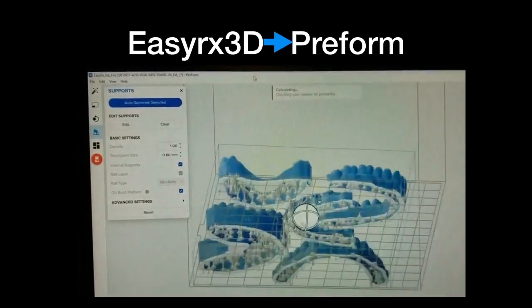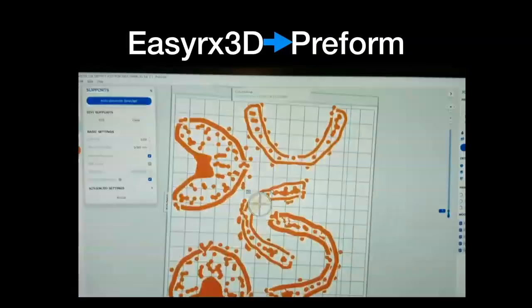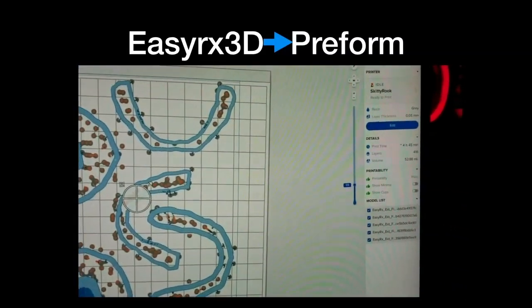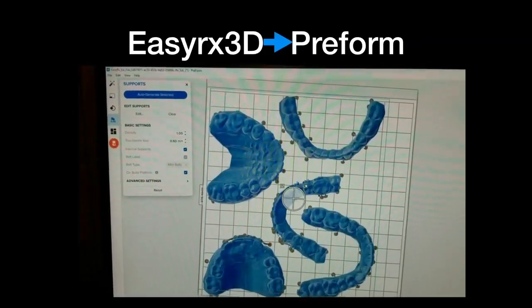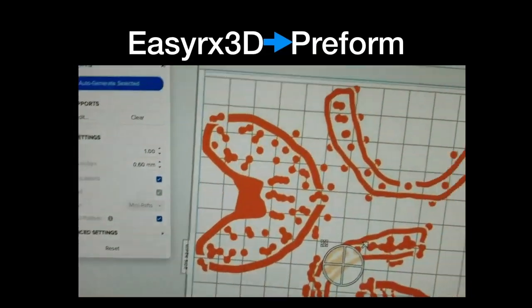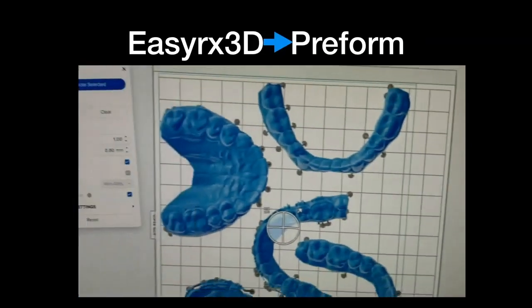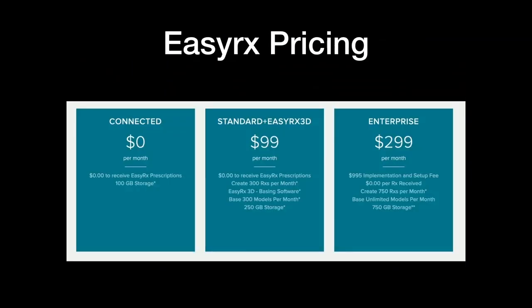So then I've created the supports, I check it. You'll see me go to the keyboard, I hit page up. You can see what the very first layer looks like. Make sure you have your drain holes in there. And you can see all the supports and you can use that slider. It's fun to do. And you can see it being built real fast. And then you get these thumbs up. You get all thumbs up, you're good to print. You're ready to go. Here's the pricing for all that.